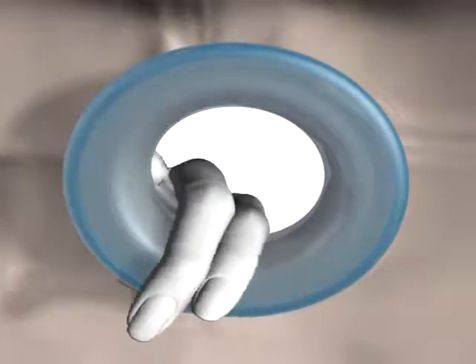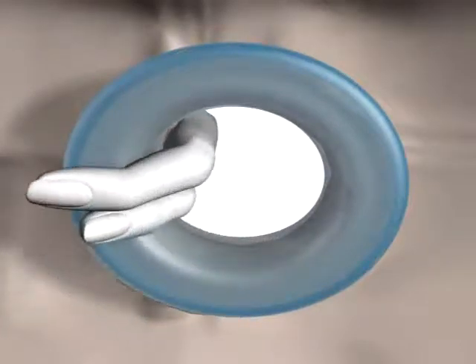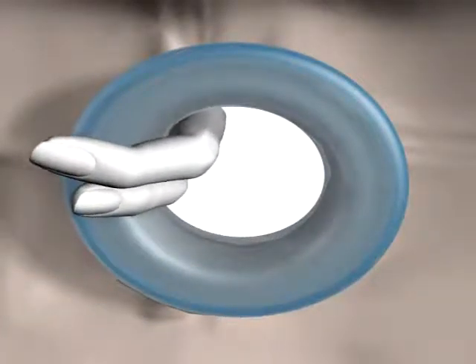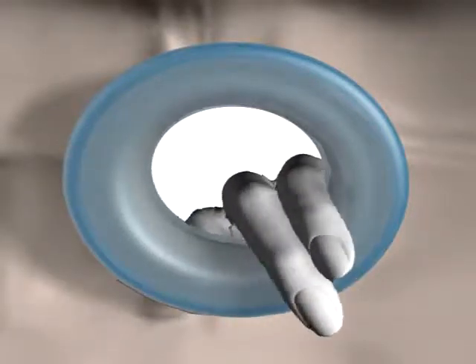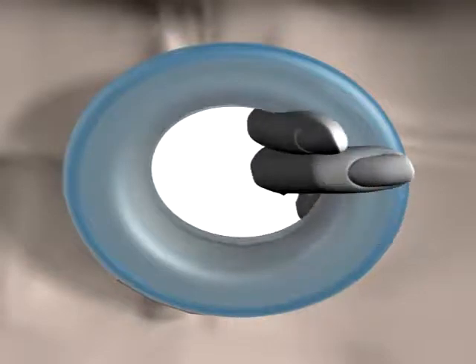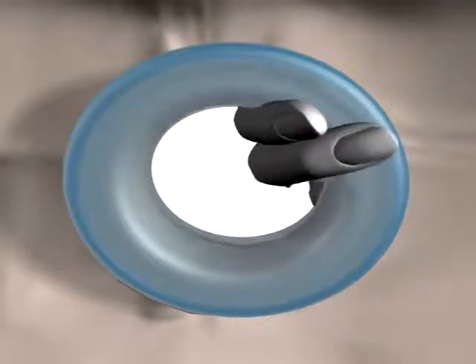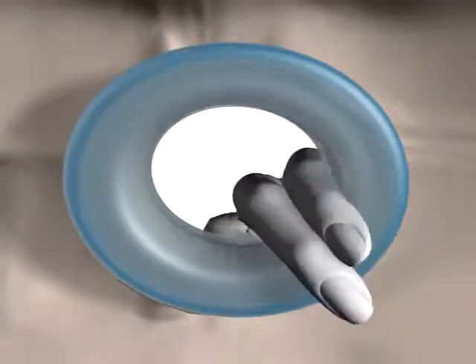Sweep two fingers along the margin between the bottom retractor ring and the peritoneum to check that the bottom retractor ring is seated securely against the anterior abdominal wall. Ensure that the bottom retractor ring is not inserted in the preperitoneal space.